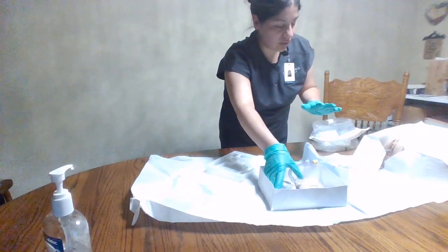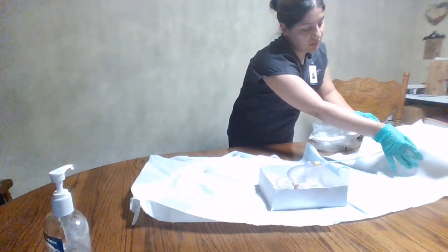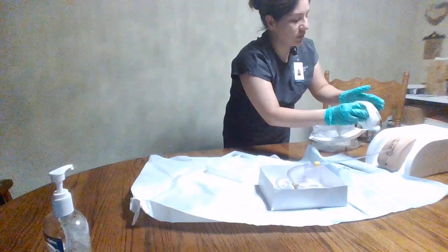All right. So I am going to take off the patient's perineal drape. Mrs. Smith, I'm going to dispose of the drape. I am going to use that to wipe you off, so we'll touch you again.